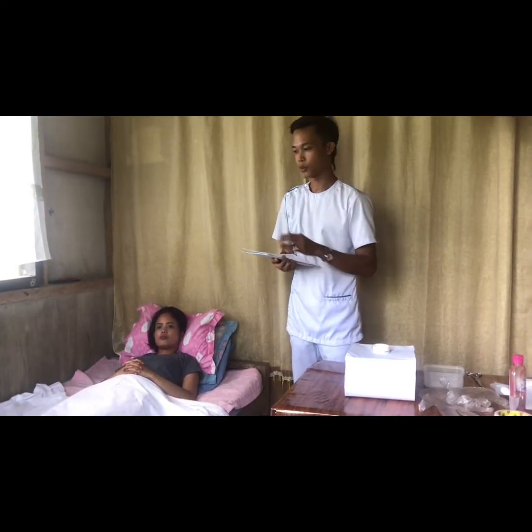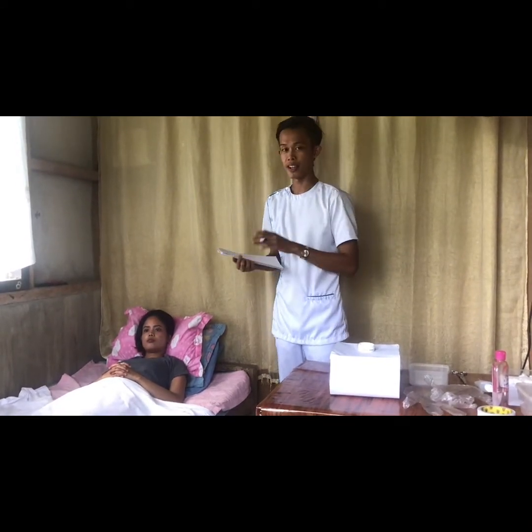After we ask for the full name and the date of birth of the patient, let us now check the medical orders of the doctor. I have here the medical orders so that we are able to confirm that the name stated in the medical orders is the same as the name given by the patient. We are not able to conduct the catheterization without the medical orders.